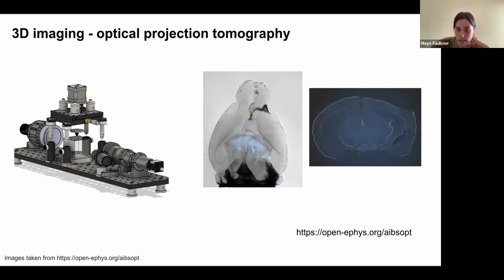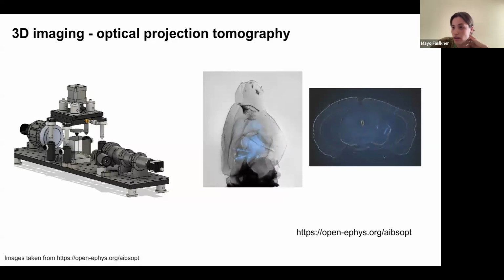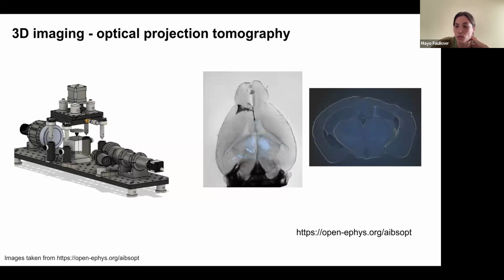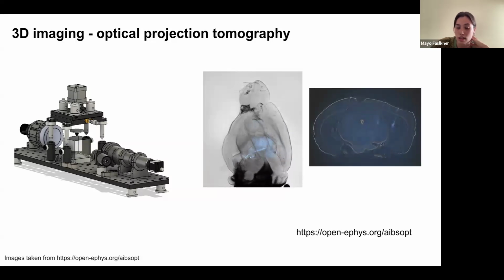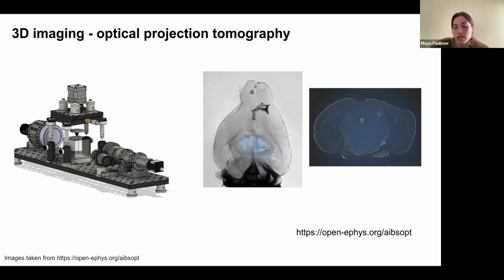This one is relatively, I think, cheap to set up, and it's available in Open Ephys. So I think if you're considering a 3D, maybe this is the one that you can set up most readily in the lab with a relatively cheap bill of materials.